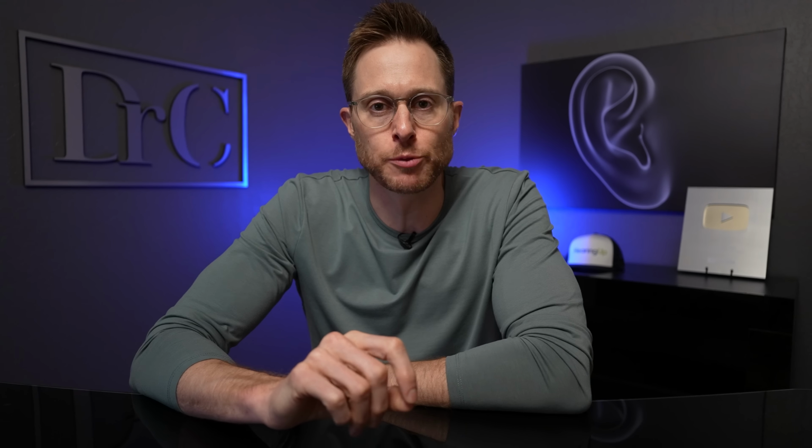I don't know what it is. It's probably something with this deep neural network artificial intelligence that it just knows what things you want to listen to. Now, there is an option inside of the programming software that your hearing care professional can toggle that will kick you out of the spheric speech and loud noise program after 3 hours, so it doesn't just drain your battery life when you don't really need to use the program.